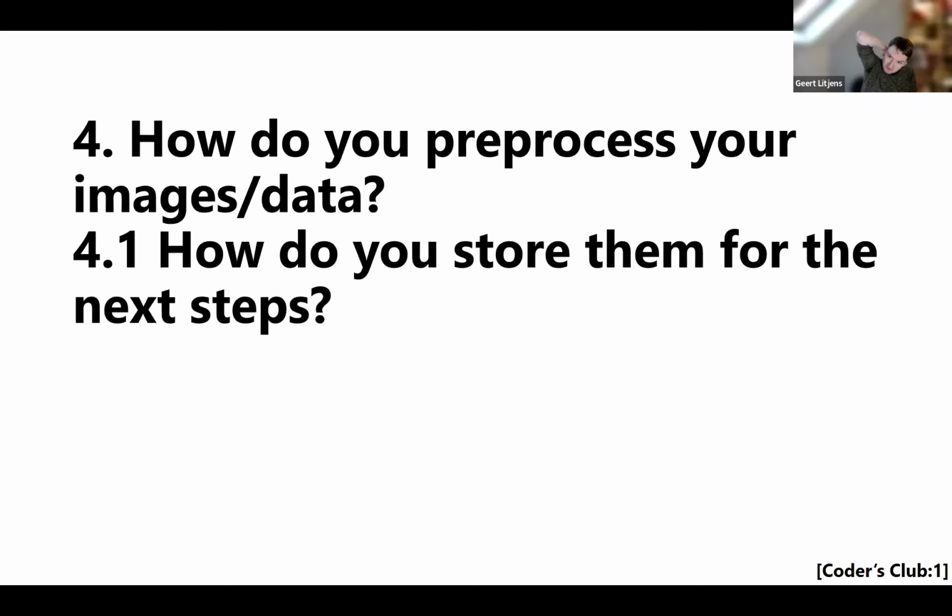Yeah, I can maybe kick this off. We actually collect most of the data we use ourselves from our archives. So lots of manual labor: cleaning the glass slides, making sure there's no dust, scanning them. Then we generally anonymize them, and we convert them to a standard TIFF format, because that's still the most widely used version. We would consider switching to DICOM at a certain point, once that's mature enough, so that ecosystem is really starting up a bit now.